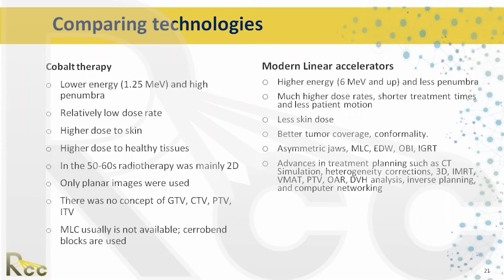And then another feature of a linear accelerator department, which has treatment planning and CAT scan, is the networking that takes place. So in a department, there is a computer network that connects the CT scanner to the treatment planner, to the treatment planning computer, back to the machine, so that everything is controlled by computers.